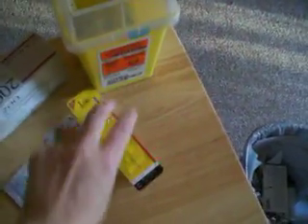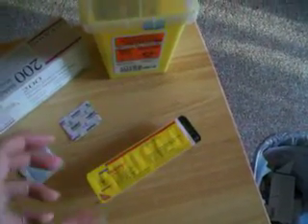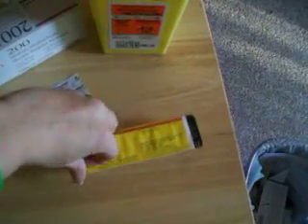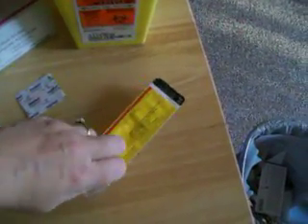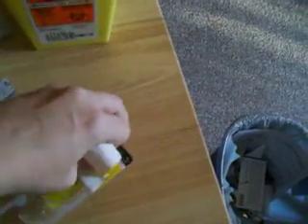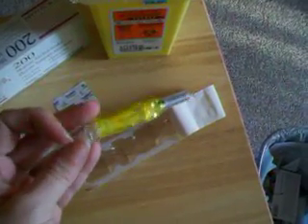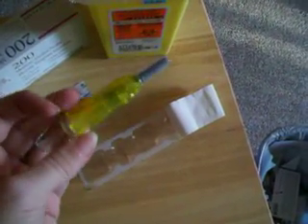So I get everything ready. I have my alcohol swab, I have my needle, and I have my sharps container. Now I just have to open the container — this is really hard to do with one hand, but the needle is inside. I get pre-filled syringes, which makes it really handy because I don't have to measure out a dose.